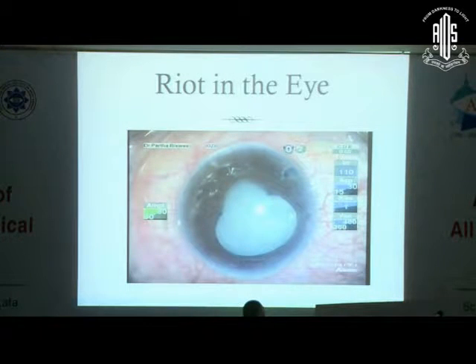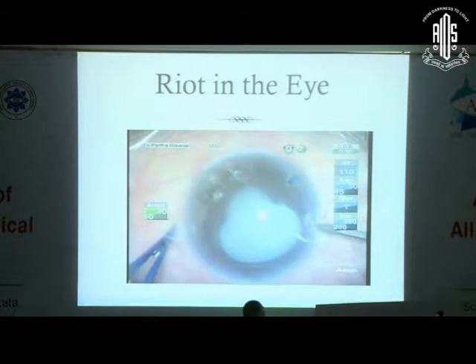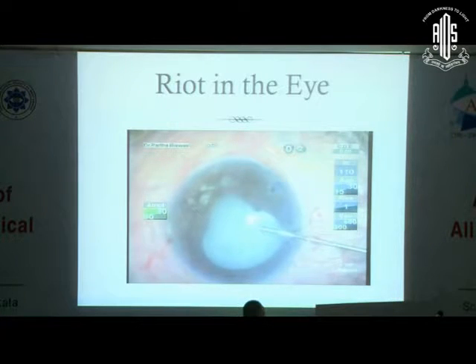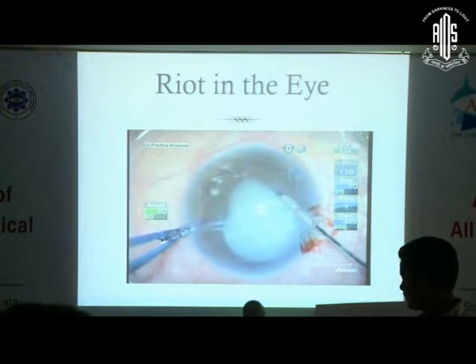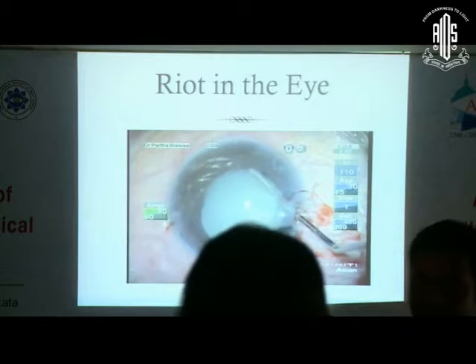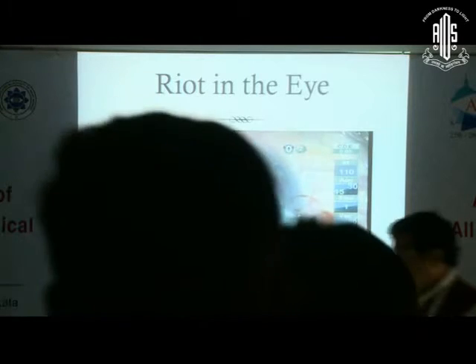After some time — just within three months — this patient came back with a total hypermature cataract. The ICL was in place. You can see the PI that was done initially during the phakic IOL implant. At that time they did not have the V4C, and there was a synechia which you can see. The synechia had to be teased off. I was apprehending many problems in this patient because two surgeries had already been done.